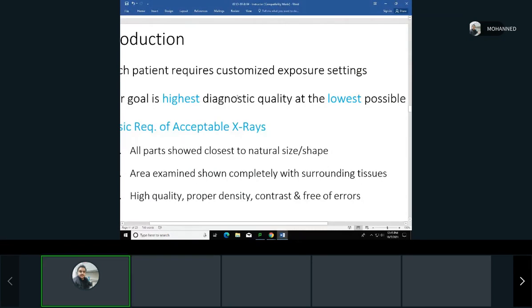And sometimes I'm sure Dr. Spina has already told you, but we don't take X-rays that are perfect all the time in the offices. They're always patient. They have different teeth and different margins, and you're not going to get it always perfect. We're humans, right? So even if we get it wrong or we did some cone cut, sometimes we're not going to redo the X-ray because it's still of a good diagnostic quality.